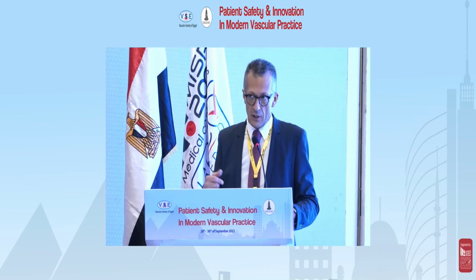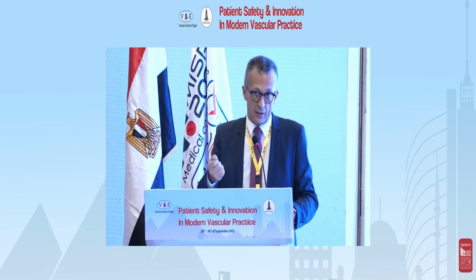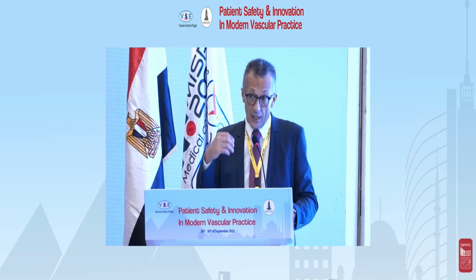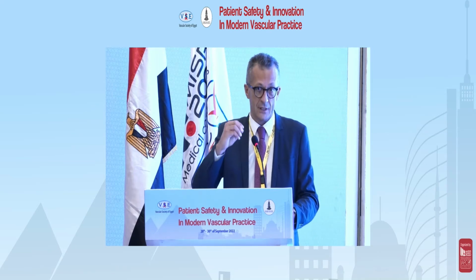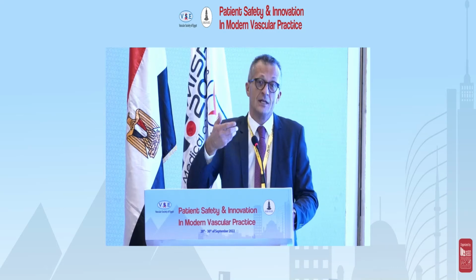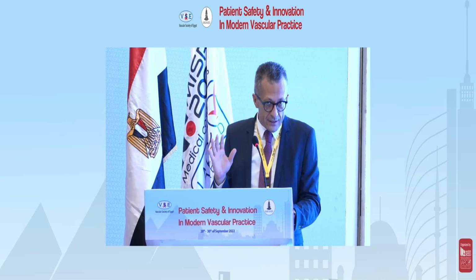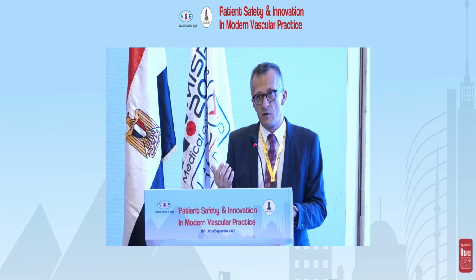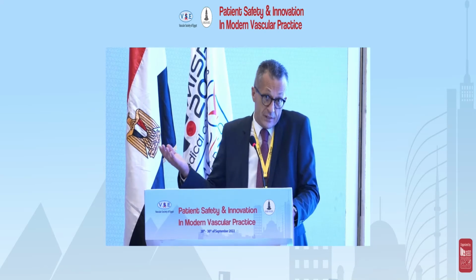When I'm sure that I removed all the material, I use Rotarex another time. I go really, really slowly through the last part, because of course at the time when I open the last cap and the flow starts, if there is thrombotic material, I have the embolization. With these tricks, I reduced the risk of embolization, and now it's around 3%, but the risk exists, of course.